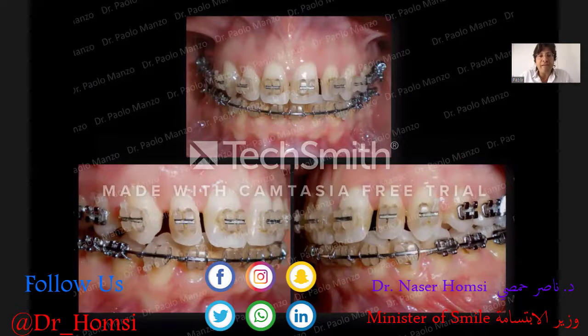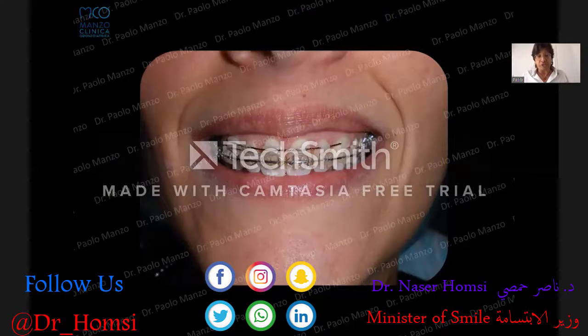When we think we are ready to remove the appliance, before doing this, usually in my experience, I try to remove the wire. I check if we have any pre-contact, any other movement, or if everything is stable, so I feel comfortable to remove the appliance. Then plus one on the right, plus one on the left, the correction of deep bite, the management of the spaces agreed with my specialist, and with my prosthetics, because now I'm going to show you what we have done.